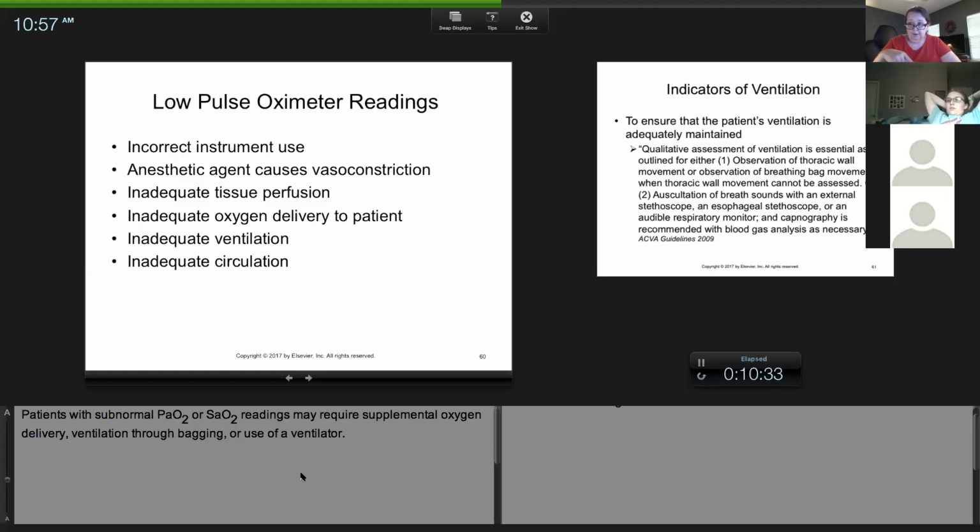I wipe it off with alcohol because I'm going to tell you, if the person before you put it on a bulldog or a bloodhound and it had a bunch of dried mucus or dried saliva on it, the light doesn't shine well. So sometimes I just wipe off the probe and put it back on the tongue, back to normal. So I clean the probe, I move the probe.